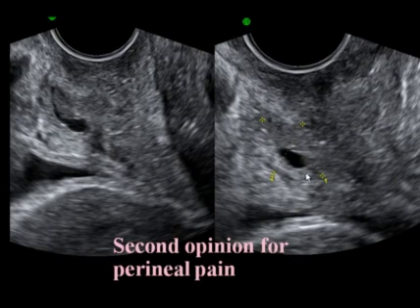And this is a patient who had perineal pain, and as we put the probe on the perineum, looking down at the vagina here, and this is part of the uterus, this is the bladder, you can see the lesion right here. There's a cystic area surrounded by a thick rind right here and right there.